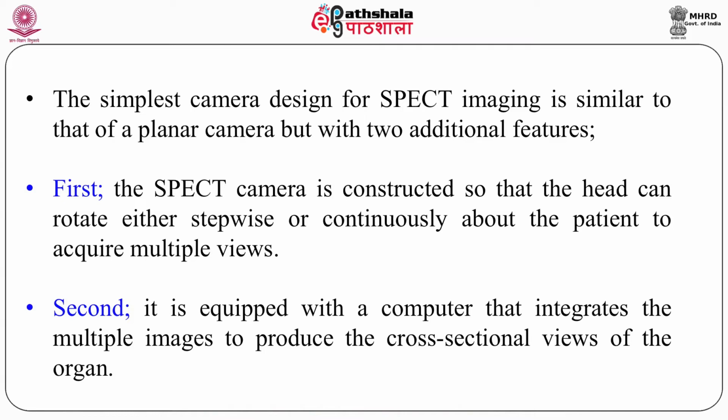The reason is that the image is constructed using different reconstruction techniques. You can see the organ moving. You can see the heart movement, how the heart is moving, what the ejection fraction is, what the viability is, where the hot spot is. Everything you can come to know by this. So there are two mechanisms: first is acquiring, and second is processing the image using a computer or reconstruction techniques.